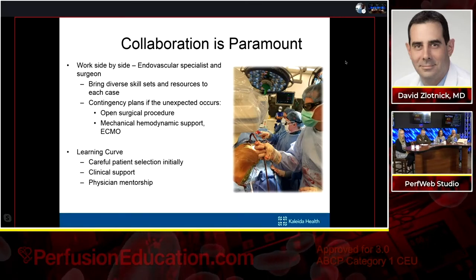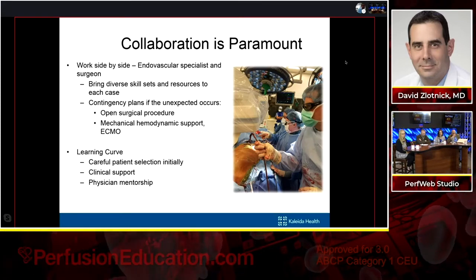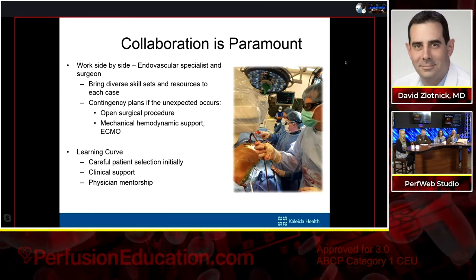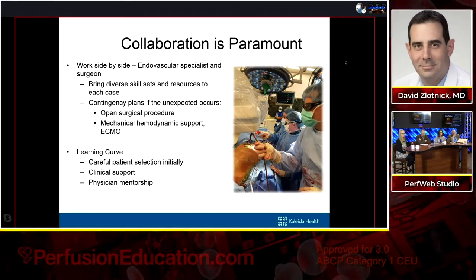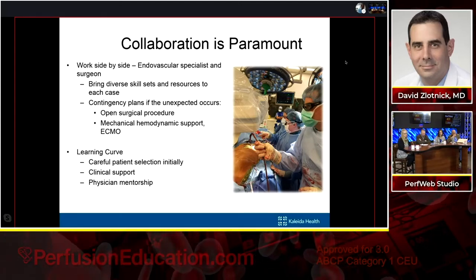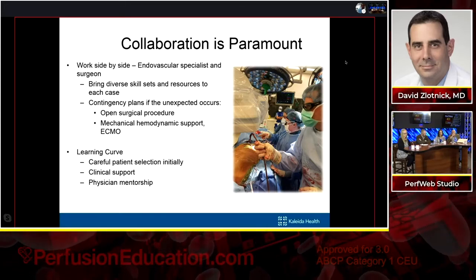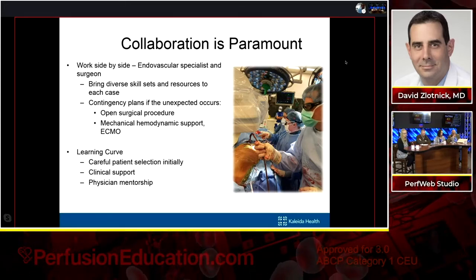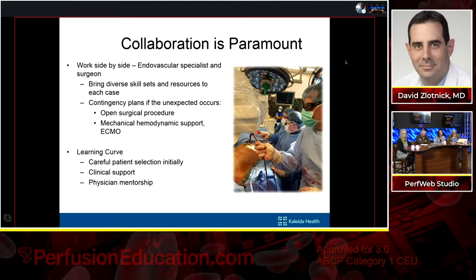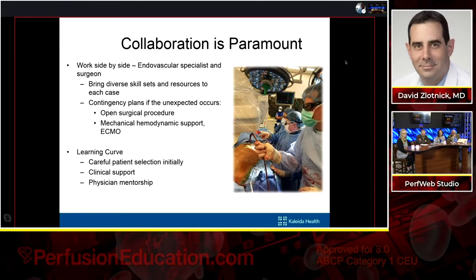One of the things that I would like to say is that there is a learning curve to these. Careful patient selection early on is going to be paramount to making sure that the program is successful. Get certain cases under the belt, get to understand how the technology and the device work. Clinical support, whether provided by physicians around the country or AngioDynamics, is important. And physician mentorship, having somebody who's done a lot of these to talk through cases, was very helpful to me early on in our experience.